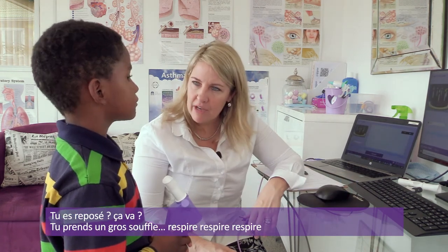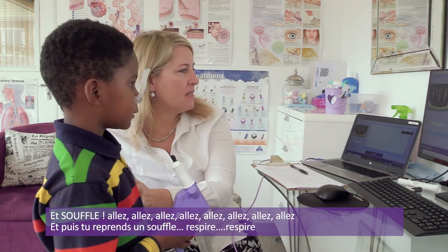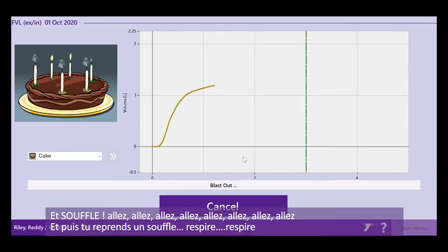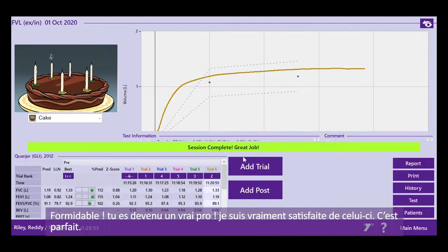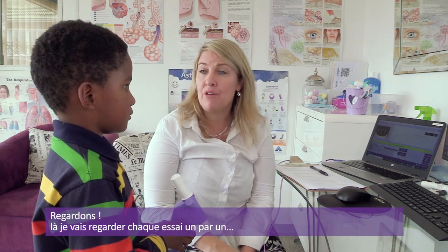Are you rested? Are you feeling okay? Good. Okay, just hold on a second. Okay, just wait here. All right, okay, you ready? Okay, take a deep breath. Fast as you can. Breathe in. Wow, you are getting so good at this. Well done. Really happy with that one. That was a really perfect one.